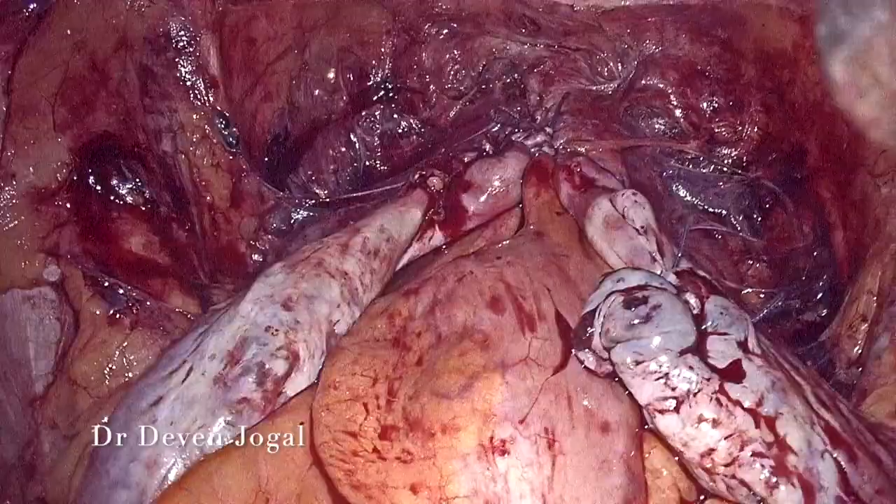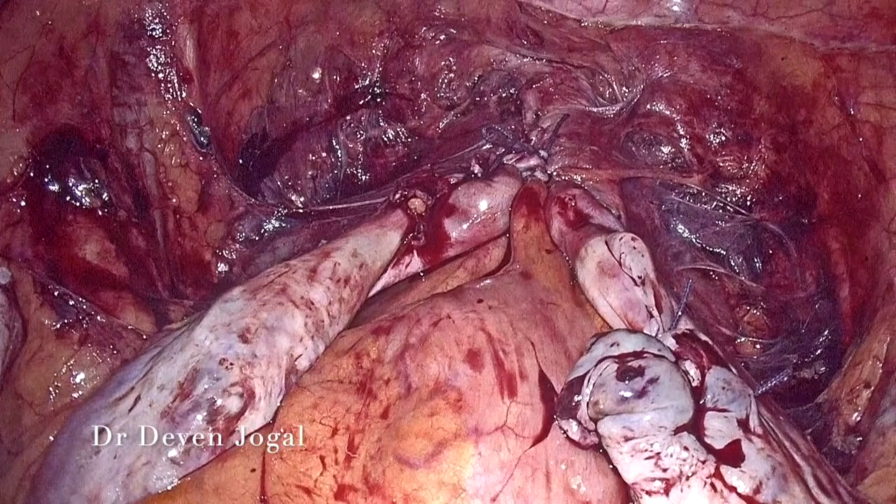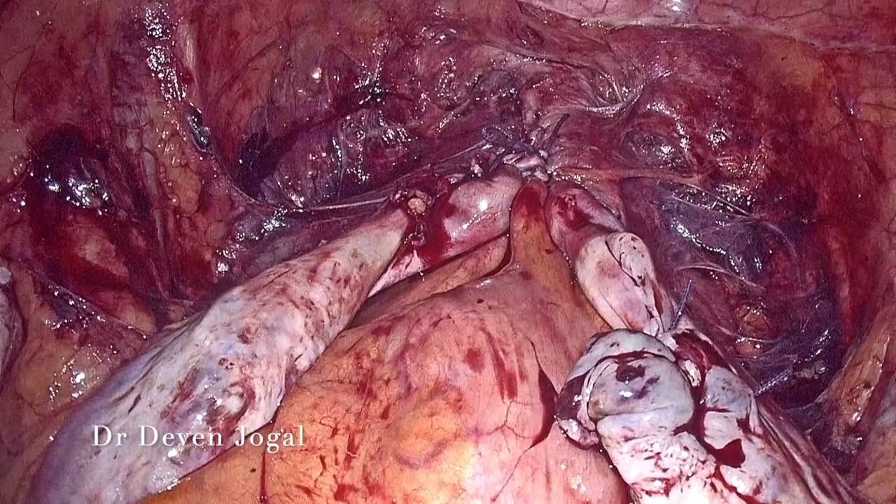This is the final end view. Almost 10 to 12 cm of vagina was created. A postoperative mold was advised to the patient. This is the vaginal end view. Thank you.